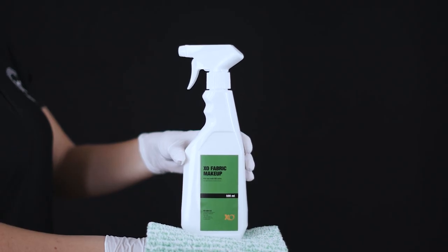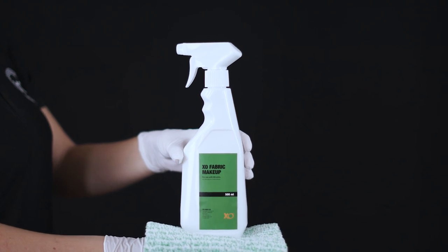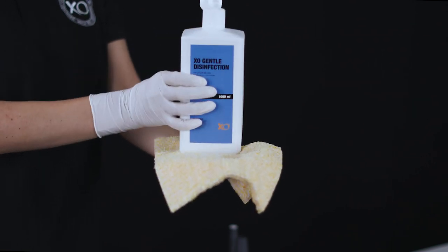Use XO Fabric Makeup to gently clean and maintain the upholstery surfaces of dental chairs and stools. We recommend that you use XO Gentle Disinfection for disinfecting the upholstery.